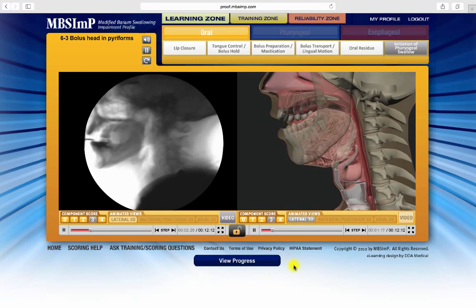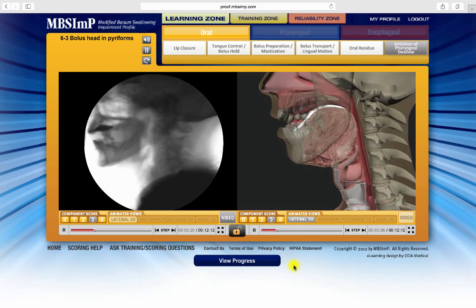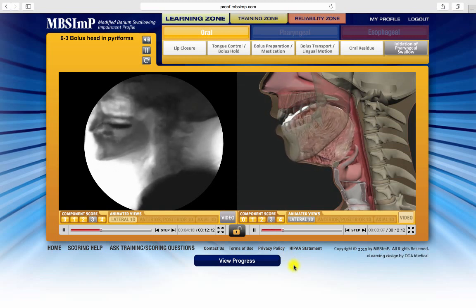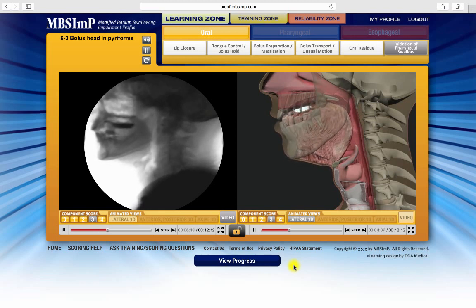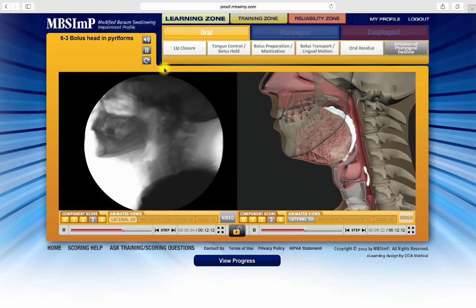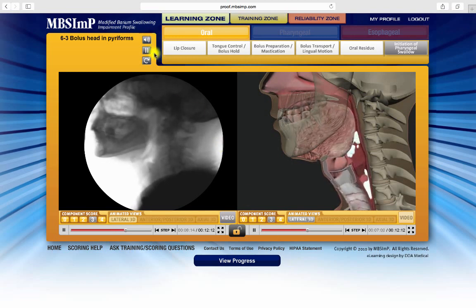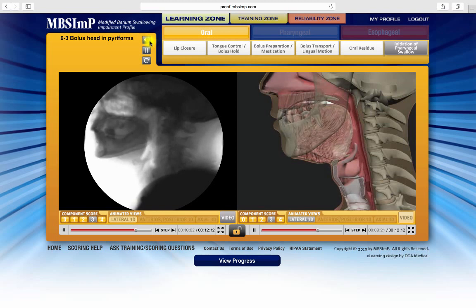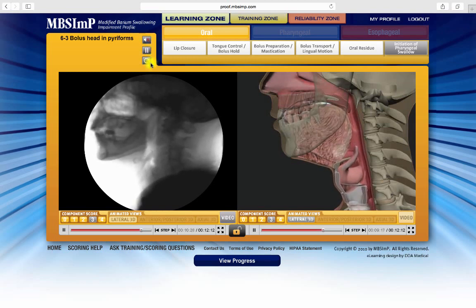These example pairs can be viewed, reviewed, and studied repeatedly. Throughout the Learning Zone, audio provides additional information about the specific score being demonstrated. The audio controls are located here and allow you to mute, pause, and replay the audio segment.